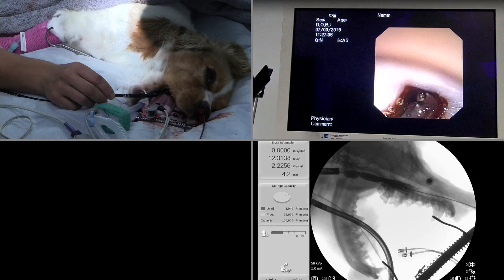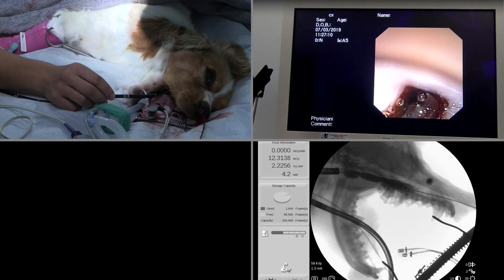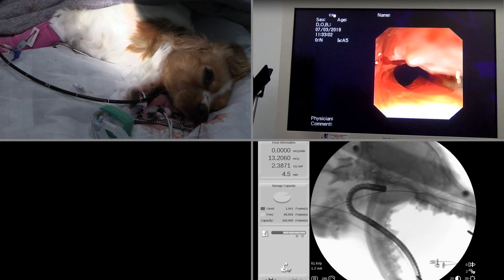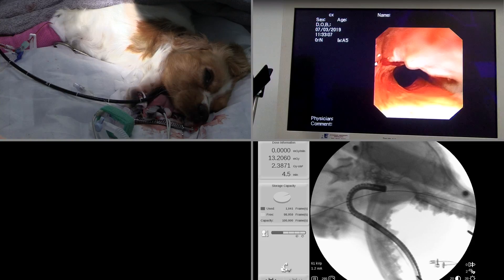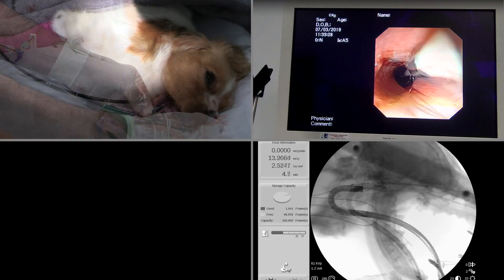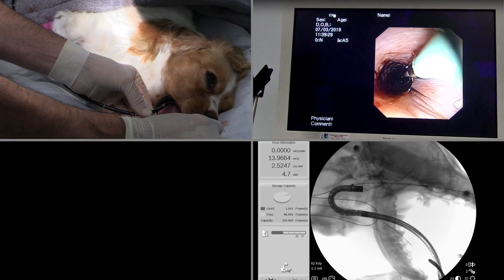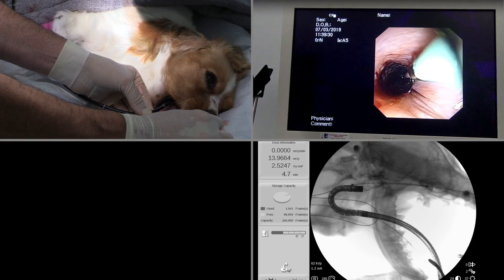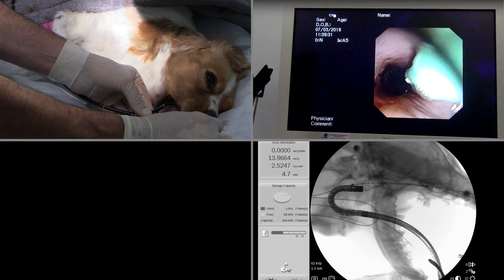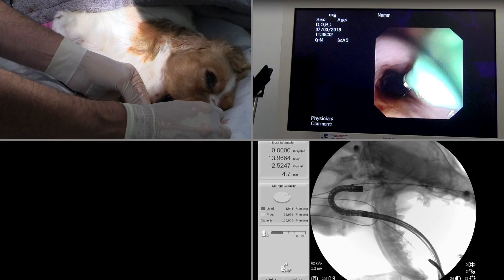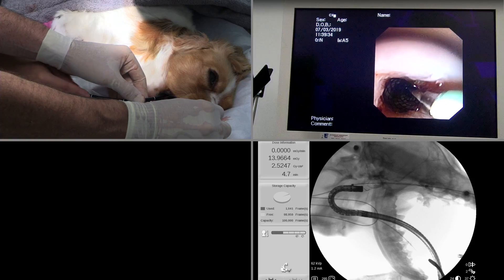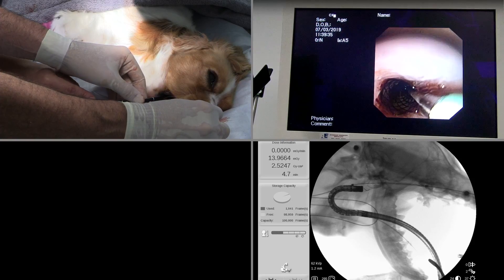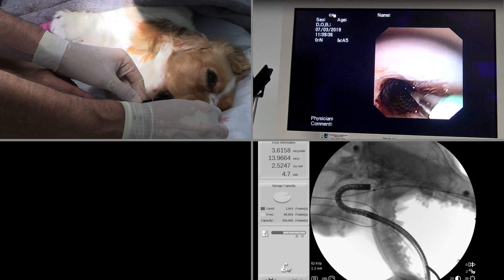At that point, we were able to visualize the nasopharyngeal region and see that the lumen was large enough for normal function. At that point, we put a nitinol stent in the nasopharyngeal region, the idea being that it's going to maintain patency of that nasopharyngeal lumen. We injected triamcinolone into the area to try to prevent stricture and scar tissue formation within the stent.